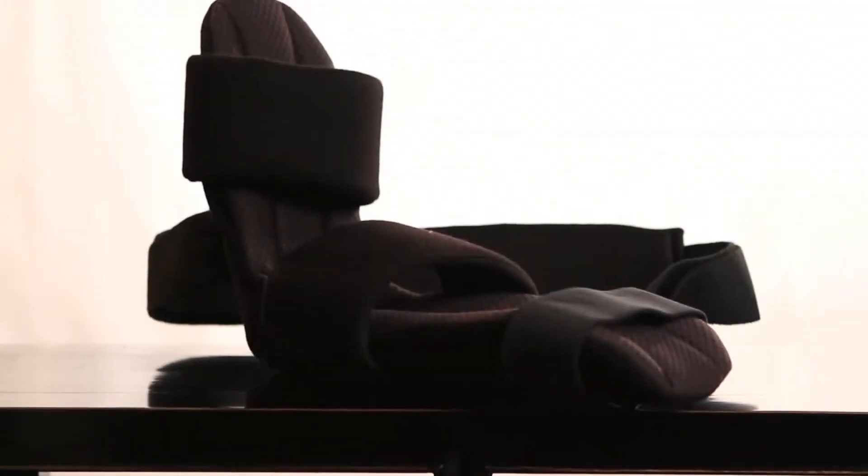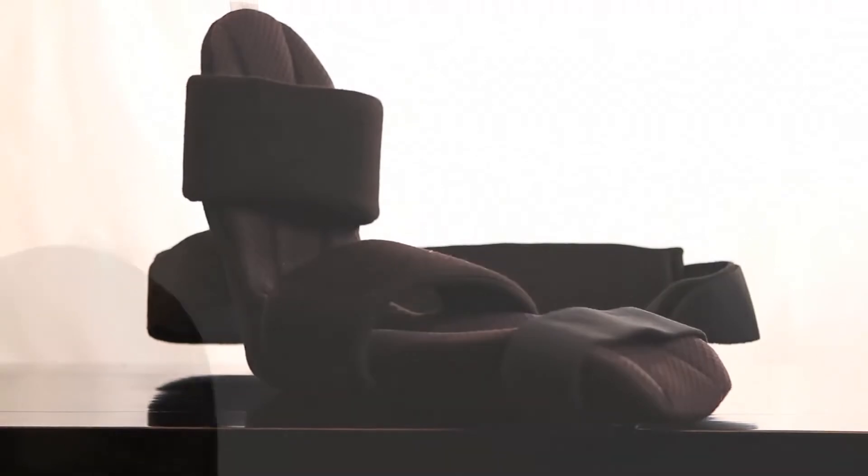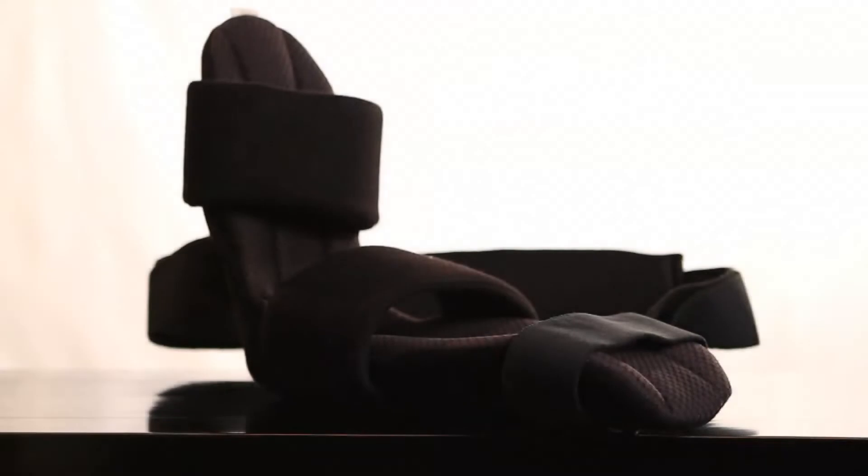The shoulder cradle from DonJoy was designed by doctors and engineers with the focus on the patient. By looking at what was missing from current braces, they have created a shoulder immobilizer that maintains the shoulder in the optimal healing position day and night.